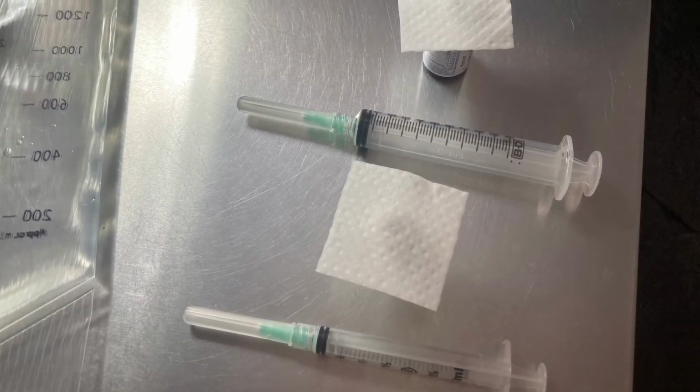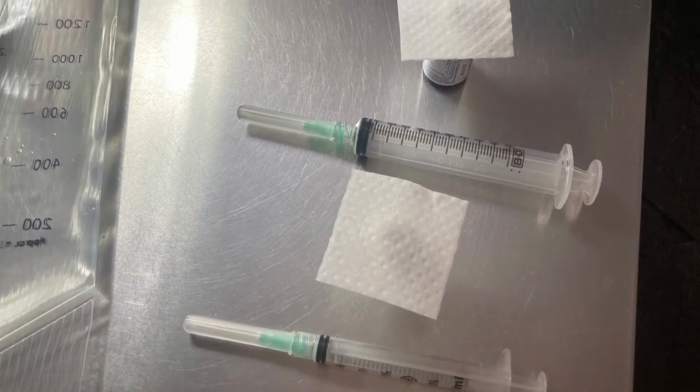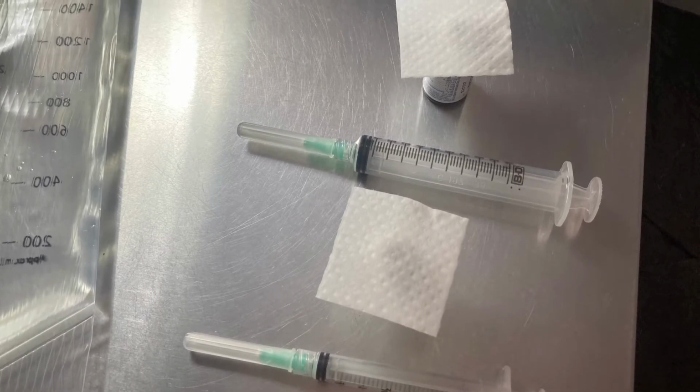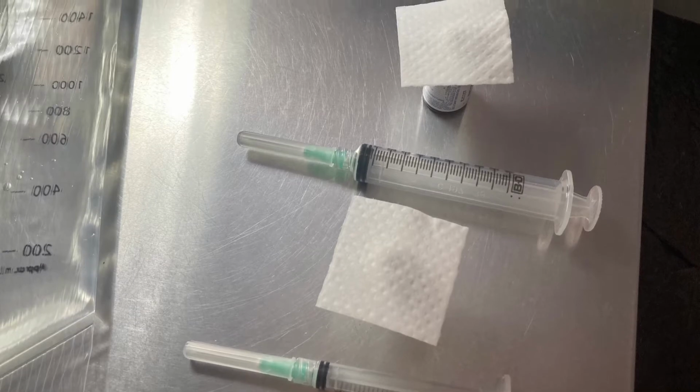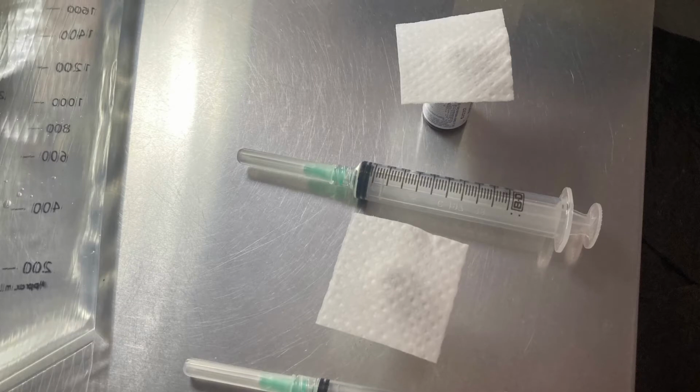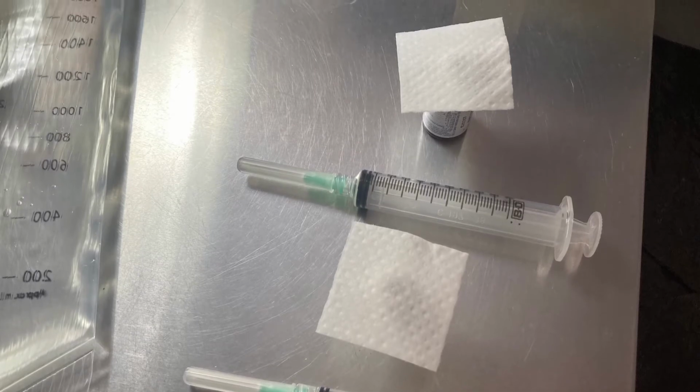Now it's time to prepare the TPN. The first thing I do is I put 2 alcohol pads on the tops of the vitamins. I do this because on more than one occasion, I go into autopilot mode and forget what I've cleaned. This just makes sure everything gets done. The rest of the wipes can also be opened.